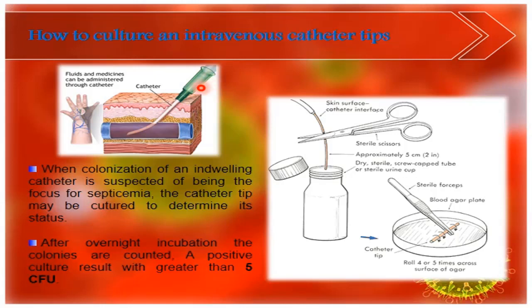We saw how colonization of indwelling catheters happens. This indwelling catheter, pushed inside, is suspected of being the focus of septicemia. The catheter tip may be cultured to determine its status.